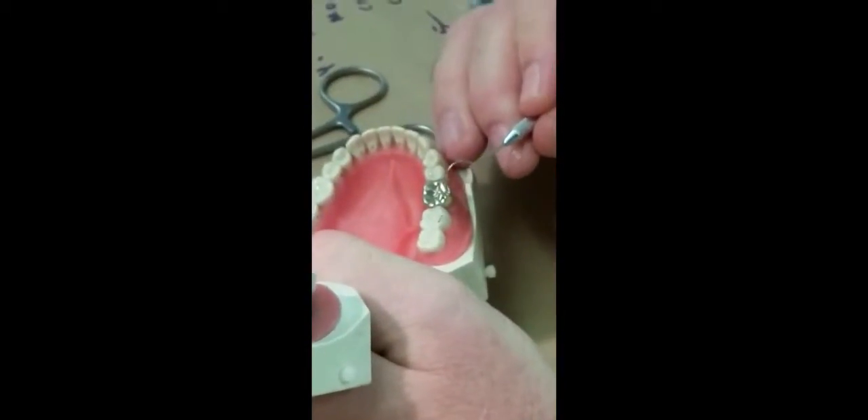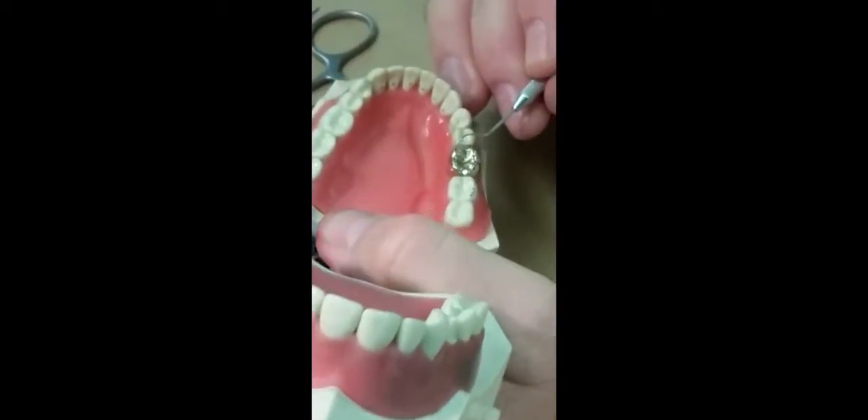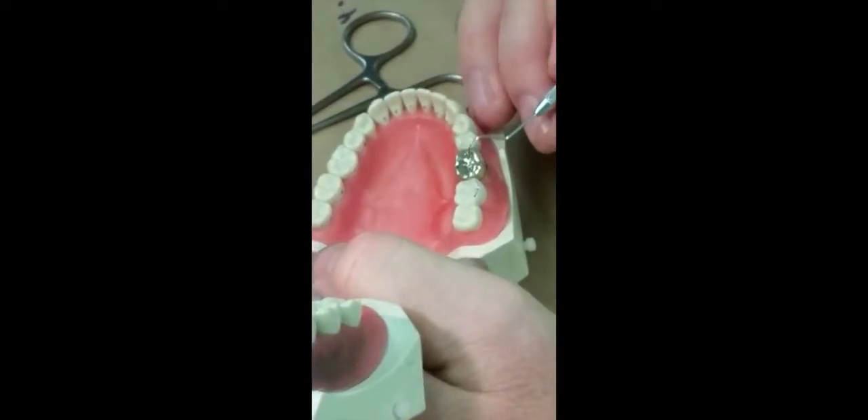Let's go through the process. If we think it's a little high because it's not contacting here — one thing I didn't do was also put the mylar on the crown. We don't want to adjust until we're sure it's in contact and not just getting artificial contact. There's nice contact on the mesial half of the crown, nice contact on the distal half. We mark it and we see contact on the distal cusp, the mesial cusp, the distal marginal ridge, and a contact in the central fossa.